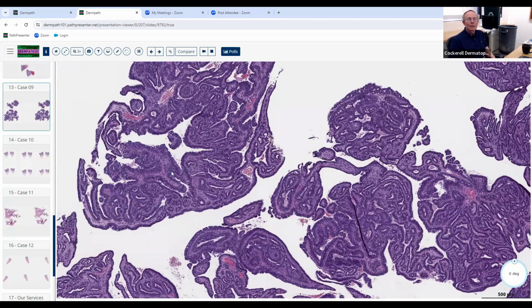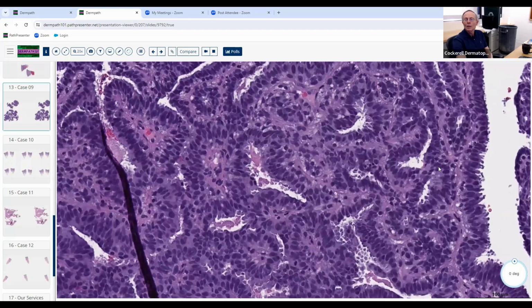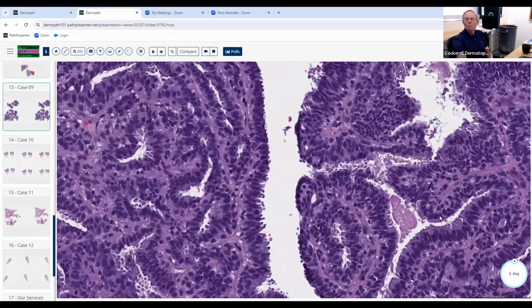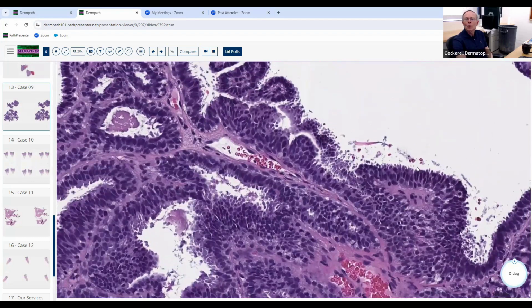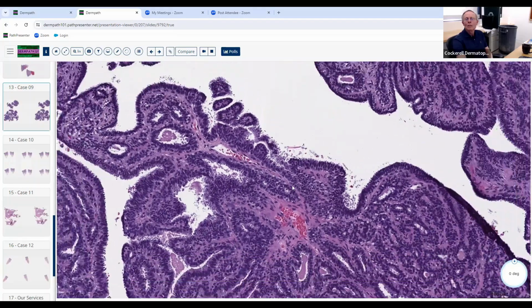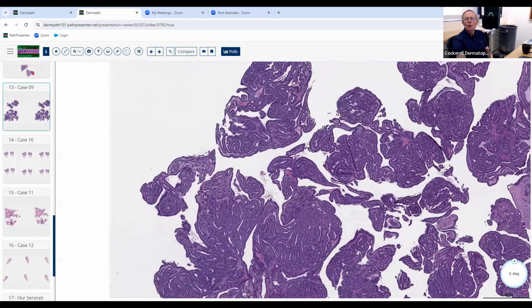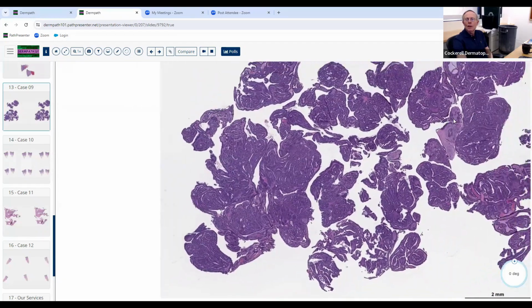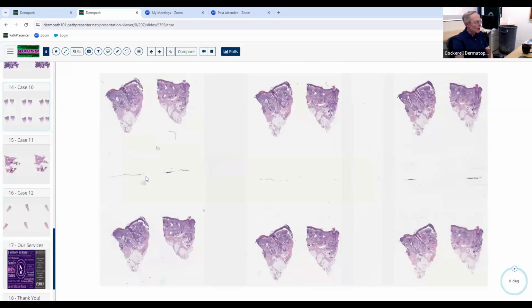It's benign and doesn't have any atypical cells in it. At higher magnification, we see no mitotic figures. All these cells are very nice. There's no pleomorphism, there's no anaplasia. Everything looks the same. There's no abnormal differentiation, and no mitotic figures are atypical. You've got the nice apocrine differentiation here. So this is a classic example of a Hidradenoma Papilliferum. And they could show you this on the exam. It's fair. They do like to show some adnexal neoplasms on there every now and then.